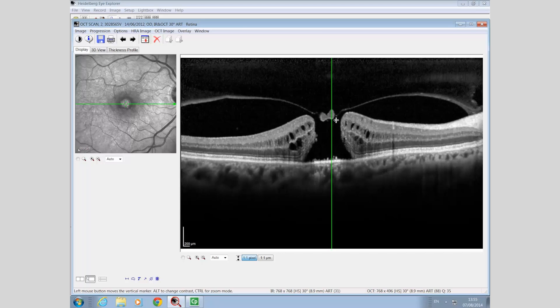The retinal cross sections show intraretinal cysts at the level of the inner nuclear layer and outer nuclear layer. The cysts in the outer nuclear layer have flat bottoms, which is consistent with vitreomacular traction.